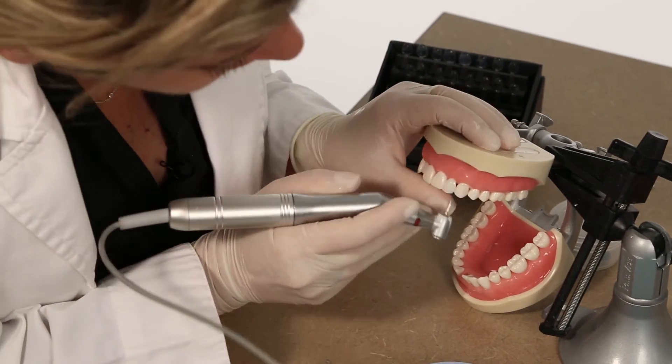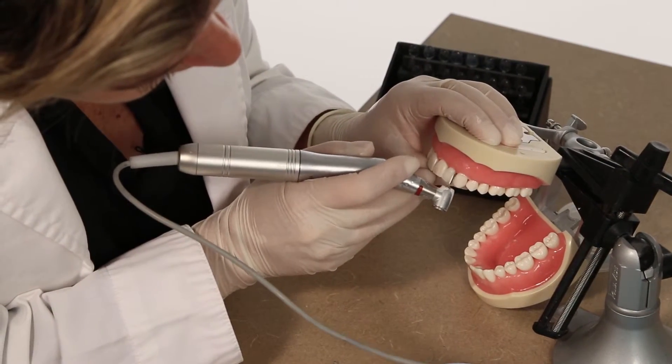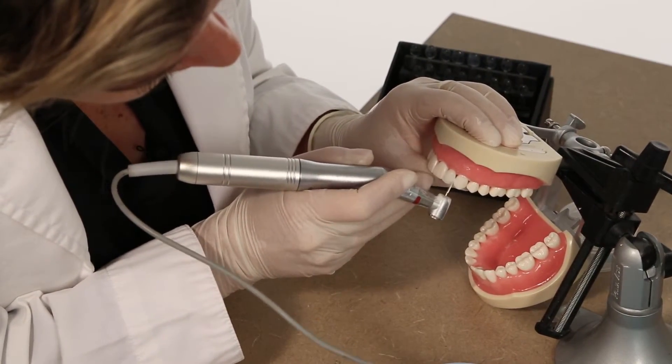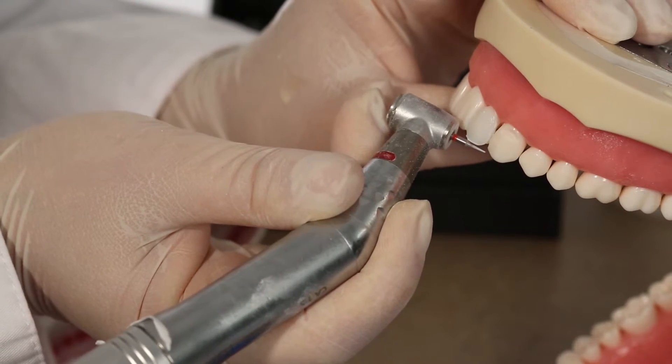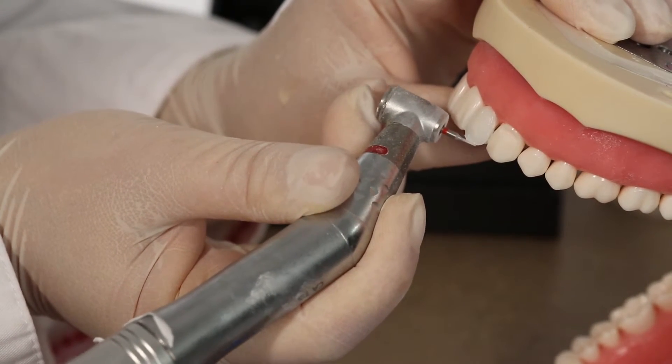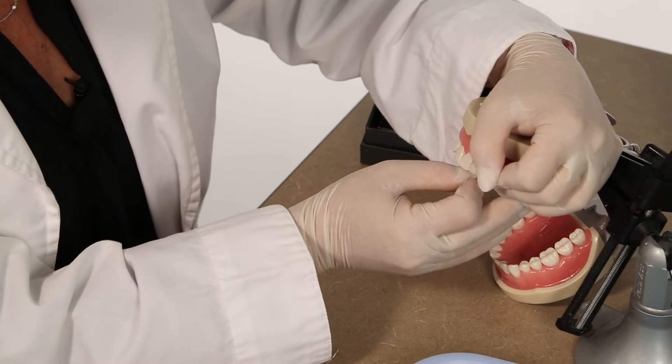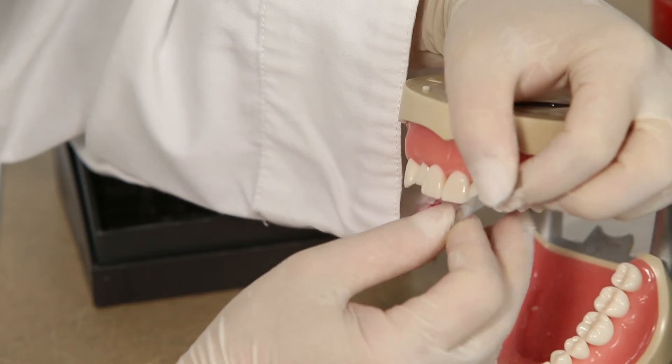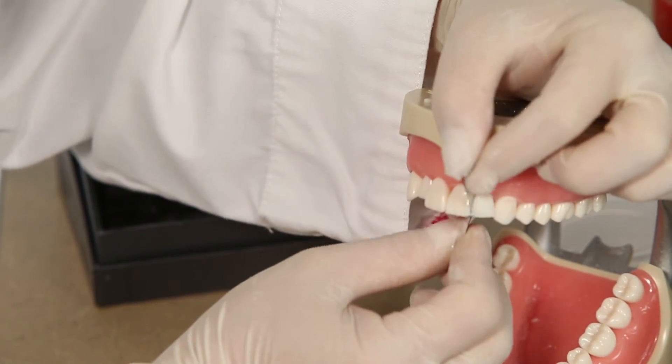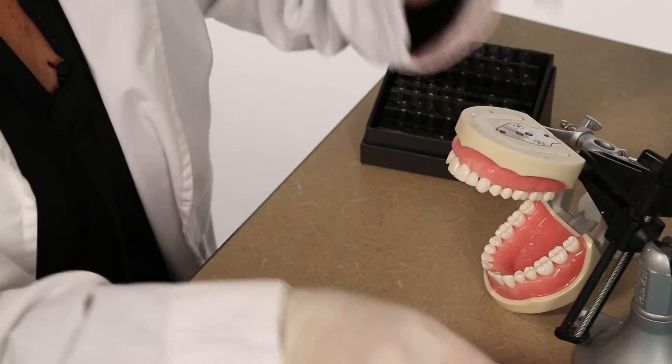In the final step, remove excess composite from the periphery with an extra fine finishing burr, taking care not to touch the glossy finish of the veneer. Finishing the veneer can be achieved with an interproximal saw followed by interproximal polishing strips to allow for clean contact points.